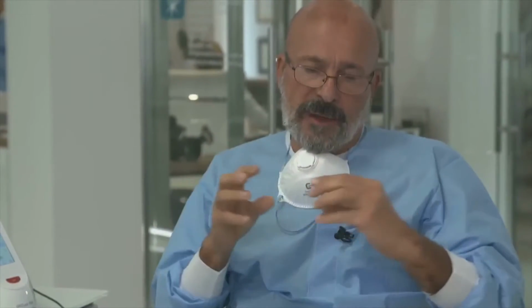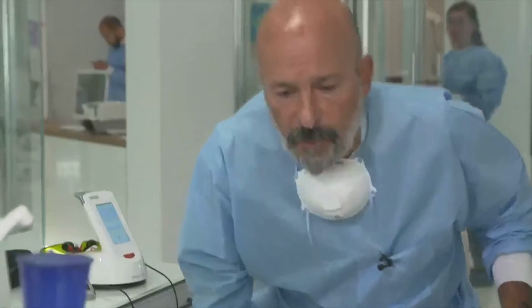So, we have hemostasis, inflammation, then proliferation and maturation. But the healing process is similar in time whether you use a normal scalpel or a laser. So you only have to expect similar timing, but during this time, the patient has no pain at all, no problem. In most cases, you do not have to put in sutures, so you do not have any contamination of the field due to the presence of a suture. So no drugs, no pain, no swelling, no problem during the healing process. And this is very important for the patient, but also for us.